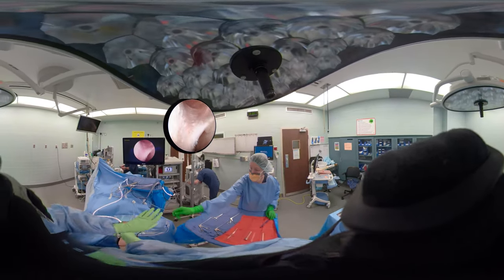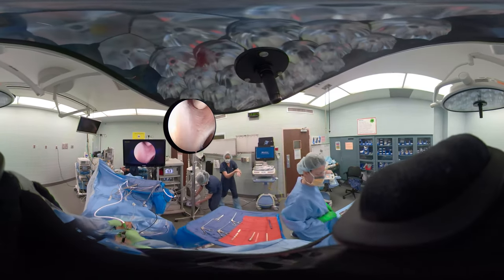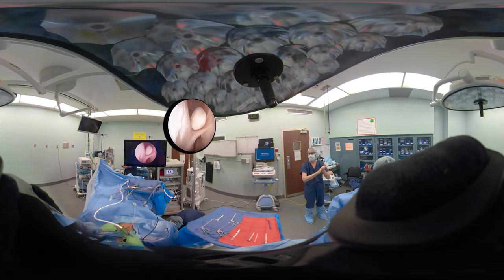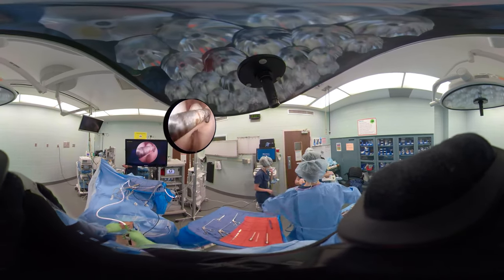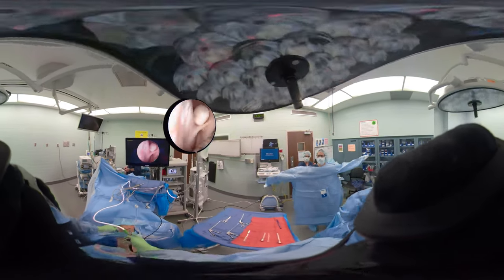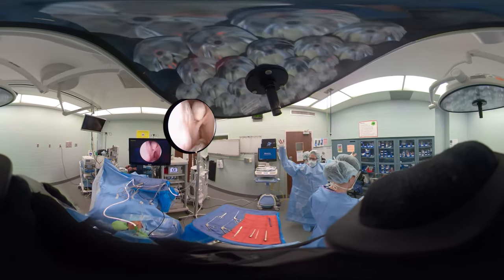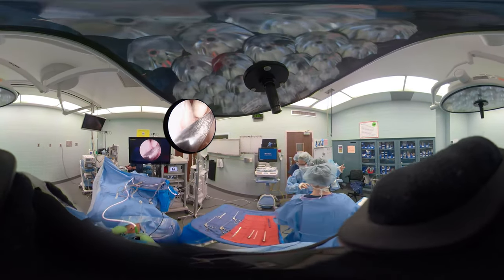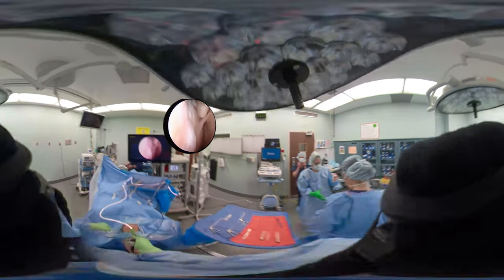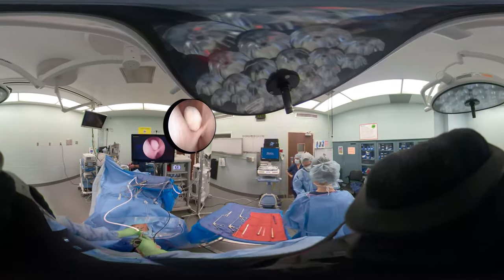Now we're looking with the scope lateral at that loose body, but we can't really reach it from that aspect. We've made the medial portal and we're probing in that area, but you can see we're having difficulty — to get the loose body out we need the working portal directly lateral. We can probe it from medial, but we can't remove the loose body unless we switch the scope to the medial portal, making that the scope portal instead of the working portal.